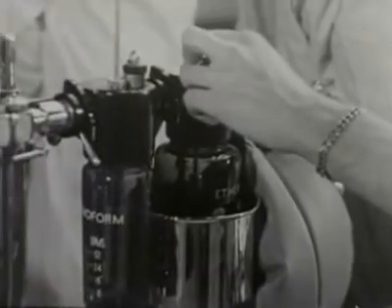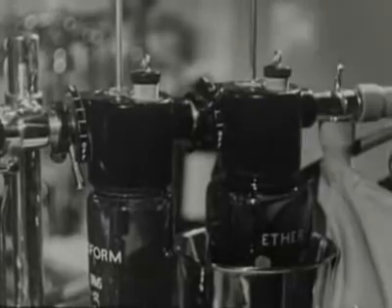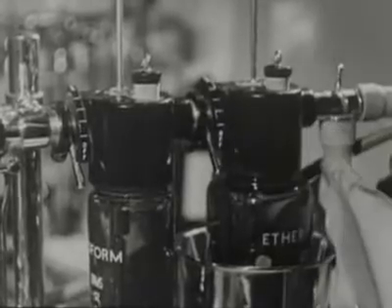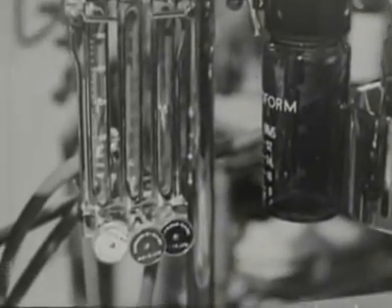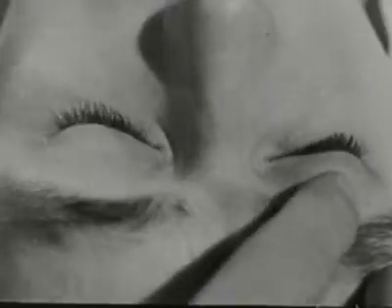The cooling of the ether in the bottle results in some falling off in concentration, but you will usually need to turn it partly off. In any case, during the last 15 minutes of most operations, the ether can be turned right off. The nitrous oxide alone will be sufficient to keep the patient from coming round, and his reflexes should return within a few minutes of the end of the operation.